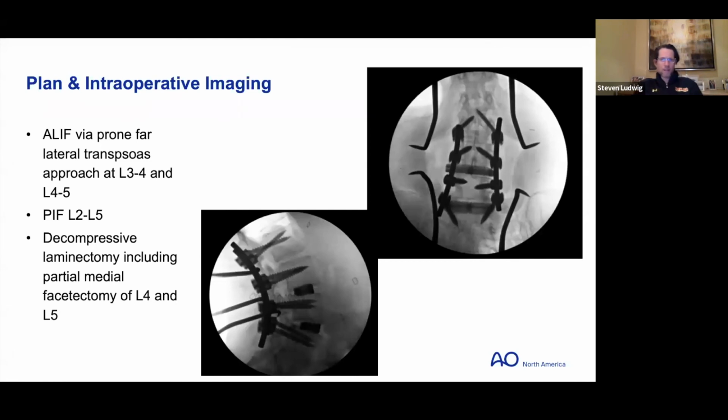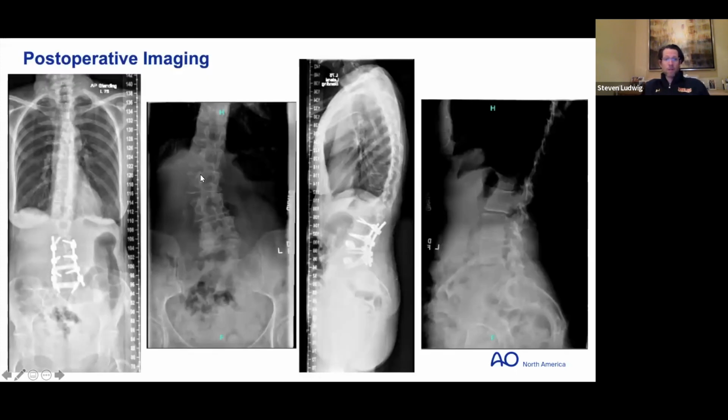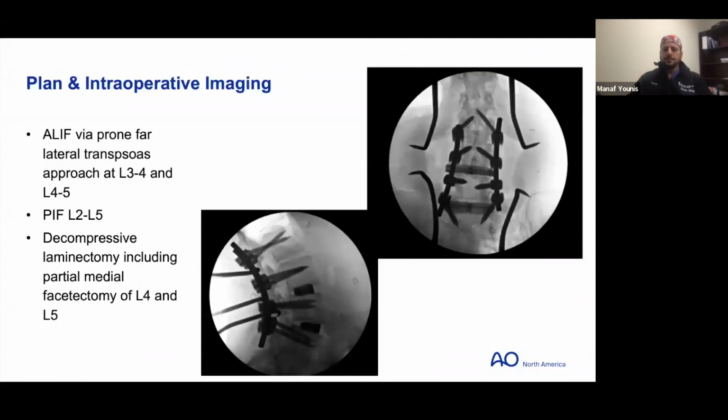So once again, this looks great radiographically. You corrected your curve. You have excellent sagittal plane alignment. It would be nice to see some long-standing scoliosis views just to validate this. But you've achieved the goals of correction, alignment, decompression, and fusion as well. You did this through a prone lateral approach. Is that correct? Yes, that's correct. Lateral-based and then posterior-directed approach.